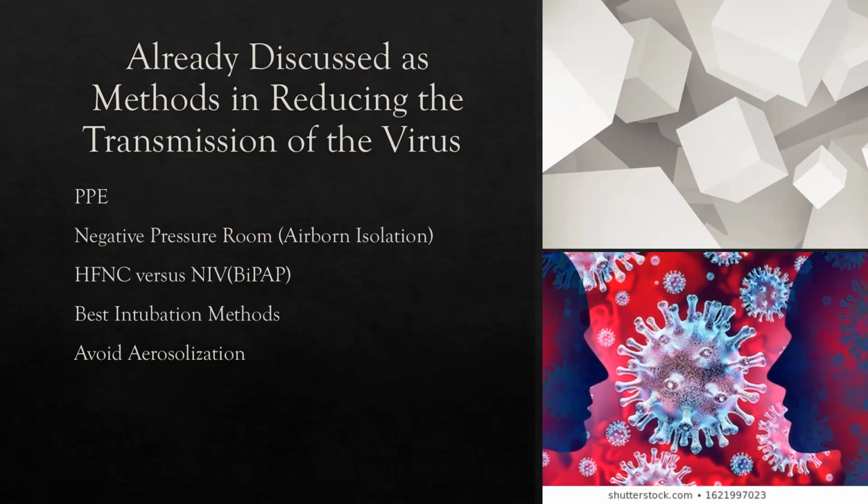So I guess if you're going to a high flow nasal cannula, I'm already making the assumption that a regular nasal cannula was not getting the O2 sats up to 90%. Non-rebreather was not getting their sats up to 90%. So now how are we going to oxygenate? Do we go right to BiPAP or do we try high flow first?